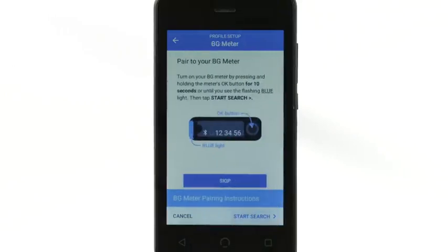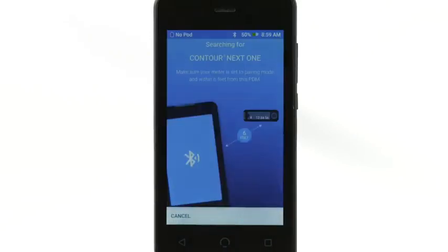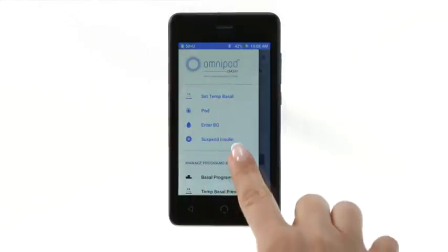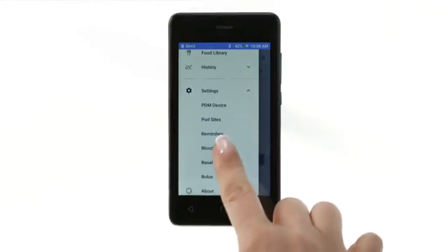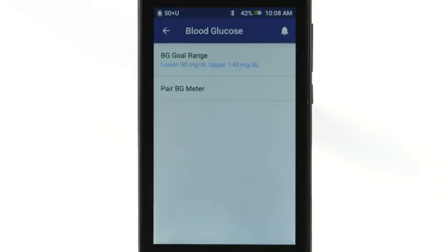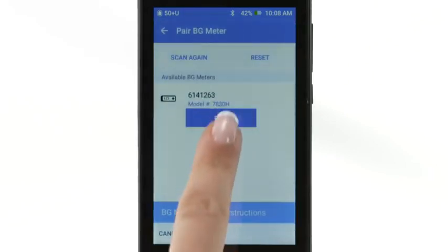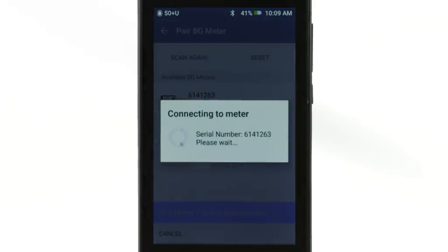You can pair your Contour NEXT1 blood glucose meter with your PDM during the initial setup, or you can do so later through the PDM settings screens. It is recommended to pair your meter first before conducting any BG readings to ensure all meter data is captured on your PDM.